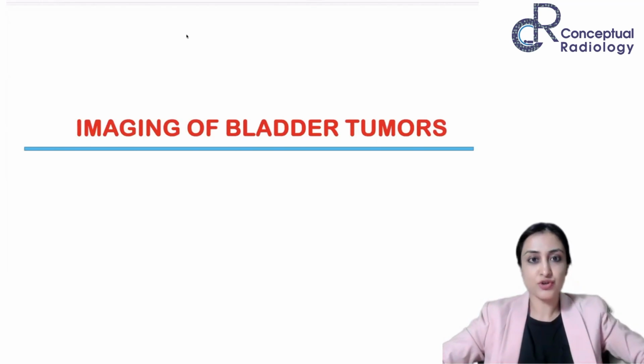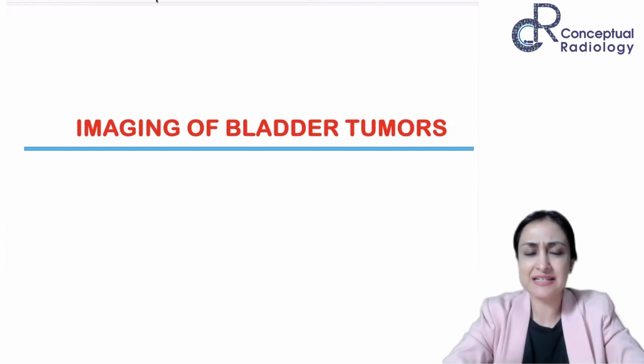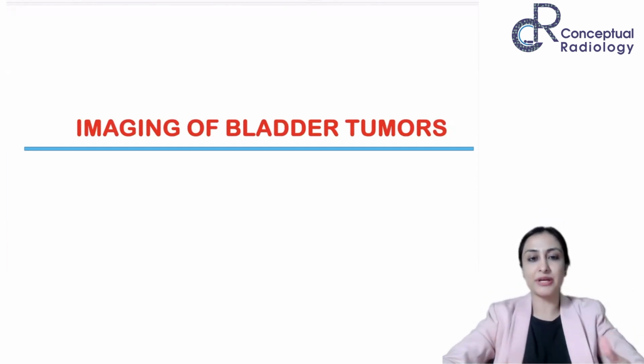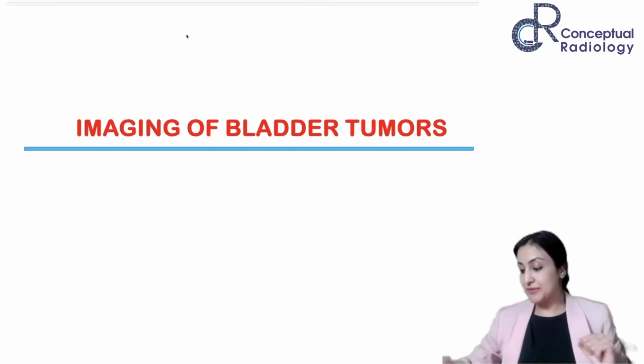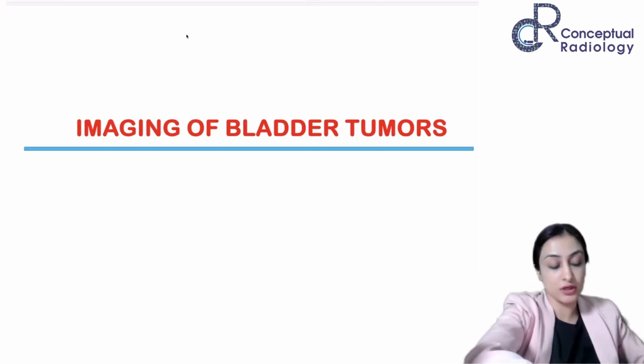So this one's going to be a short class, and this is a short topic. And as JRs, you must pick up bladder imaging cases if you ever get them, just pick them up for reporting. So this is all about practice. The more you see bladder MRs, the more confident you will become. Okay, so let's go. What we will mainly be discussing is VIRADS and how we score bladder tumors.